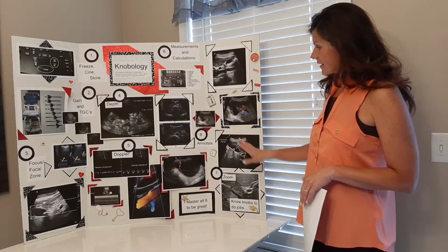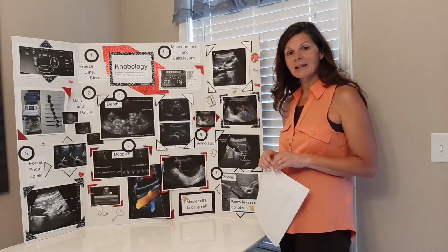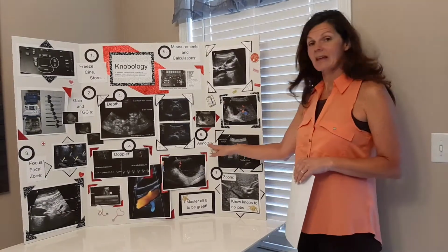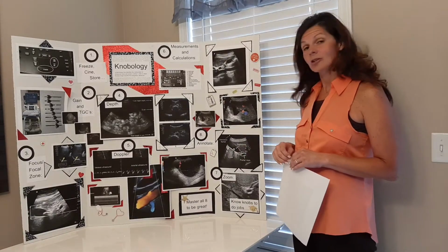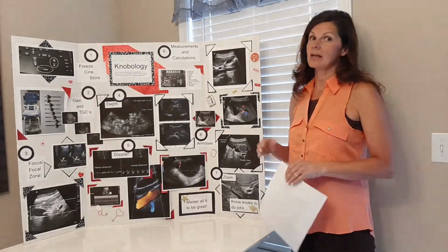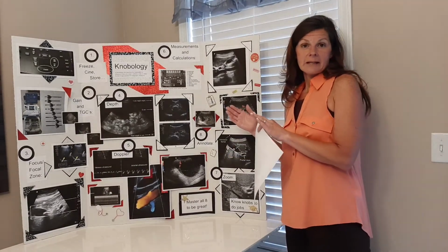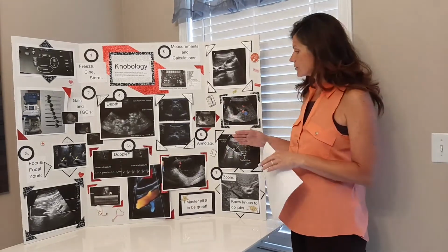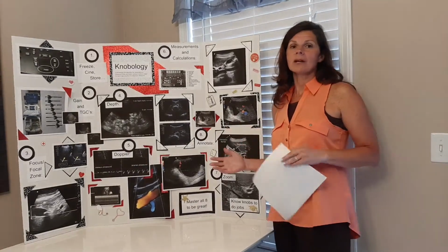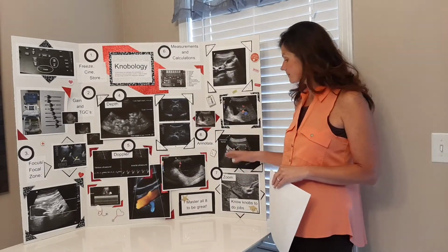The final knob that you want to know where to locate on the ultrasound machine is actually the annotate button. And you are actually going to label your image. You're going to let the radiologist know, hey, I'm scanning the left kidney, and instead of the right kidney. If you don't label it, then they don't know if it's the right or the left, but you're indicating what body part you're actually scanning.